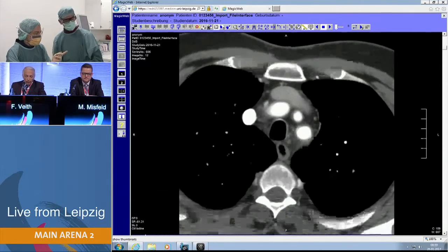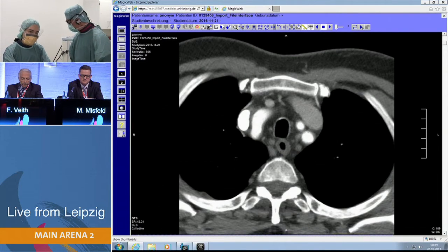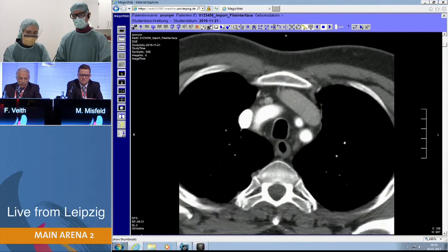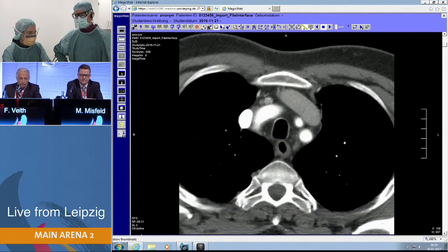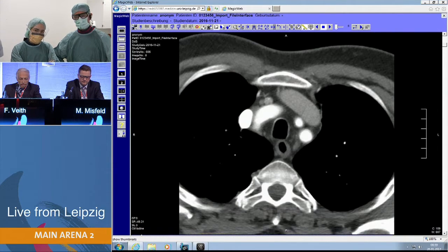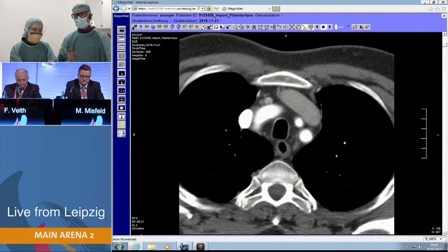This patient is also monitored — he has two electrodes on the upper lumbar area. We have done that in cooperation with the Heart Center. So far, in our endovascular cases and also in the surgical cases after coiling and stenting, we have not noticed too much movement in the saturation in the NIRS measurements.